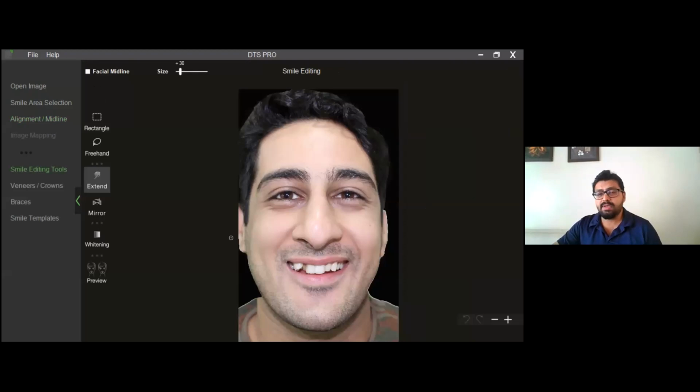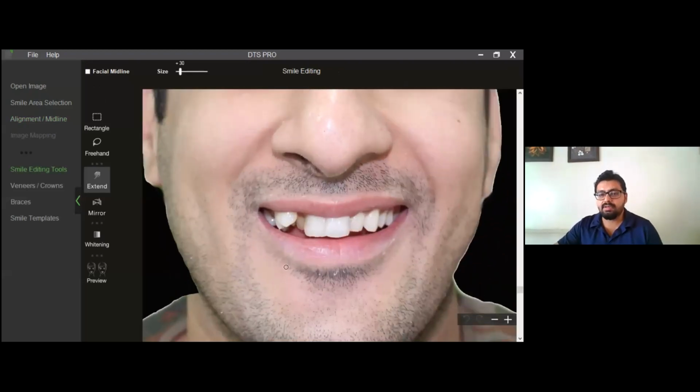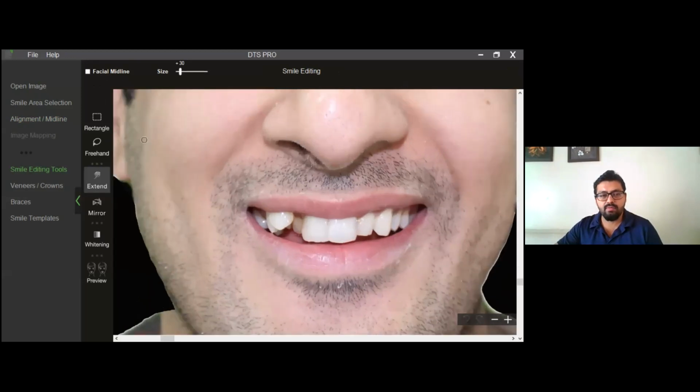These guidelines would become even more applicable and practical after dentistry starts back in the post-COVID era, because there's going to be a lot of virtual consultations. There's going to be a lot of online consultations where these tools can be used to actually motivate the patient even without seeing them. You just have a photograph of a patient, make some simulation which motivates them in the first phase to come to a dental practice and start their treatment, right?